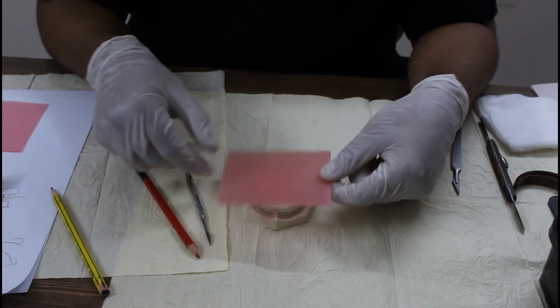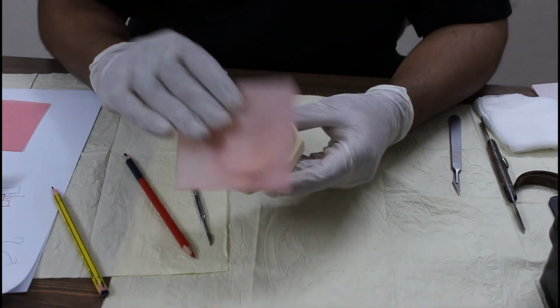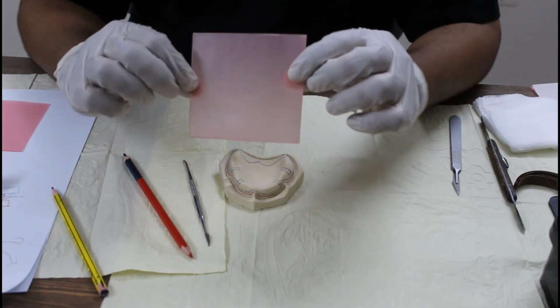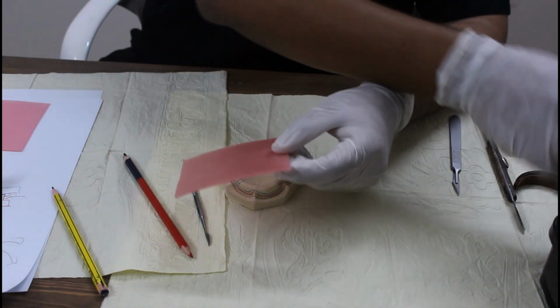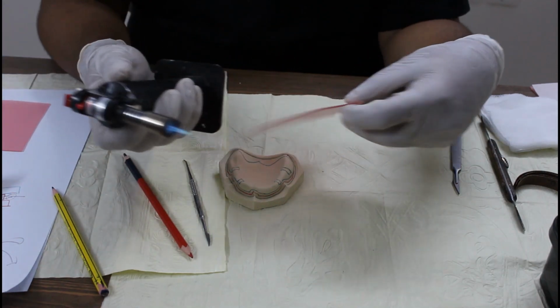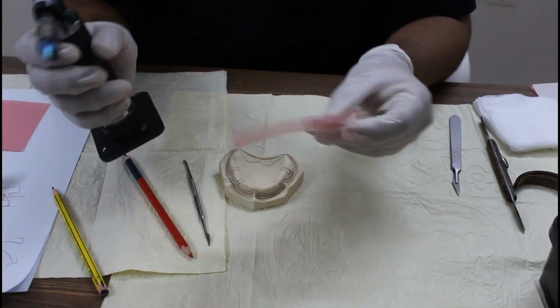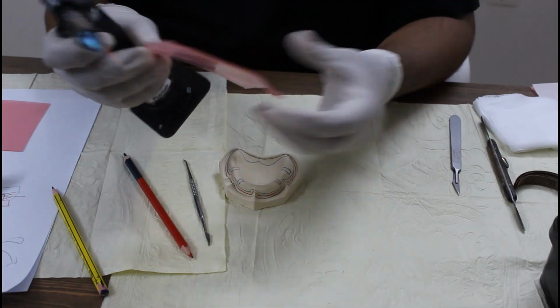Okay, now you have to adapt this wax sheet on this cast according to this cast. Now this cast is not flat, wax sheet is flat. Now this wax sheet, if you try to bend it now, it might break. So what you do, take your torch, switch it on and make it soft. When you are making it soft, do not overheat the wax. The wax should not melt. Okay, you just have to make it soft.